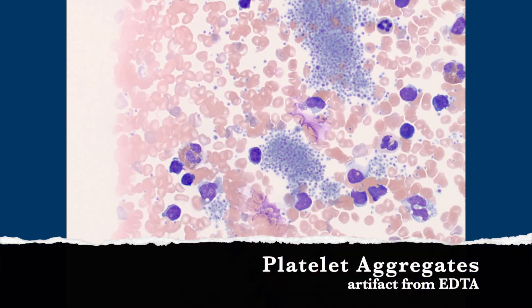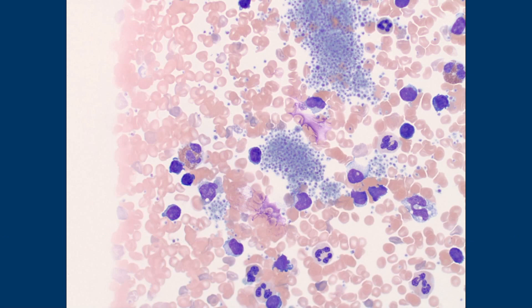These are platelet aggregates, right? And these are the ones. So this is the one I told you we talk a little bit more about EDTA. This is an EDTA artifact, and in some patients this happens.